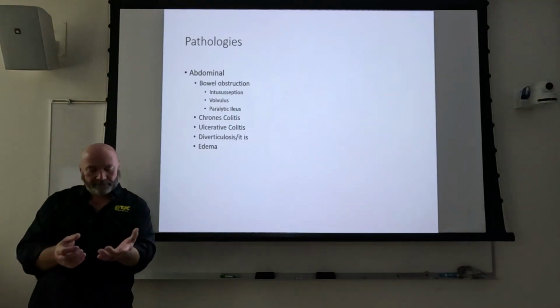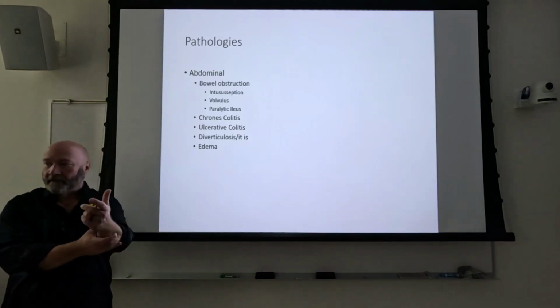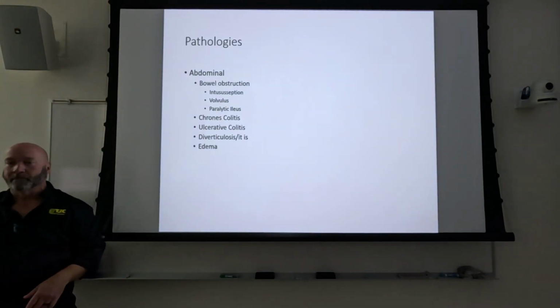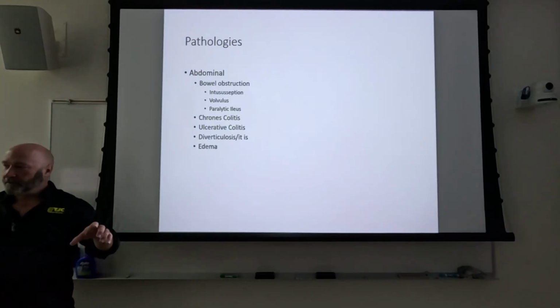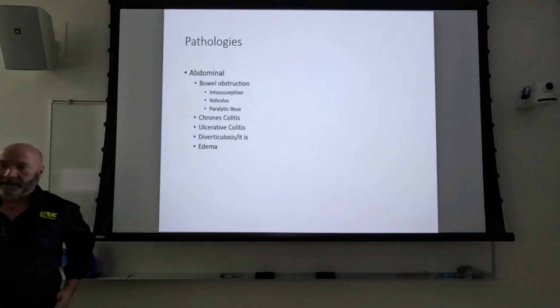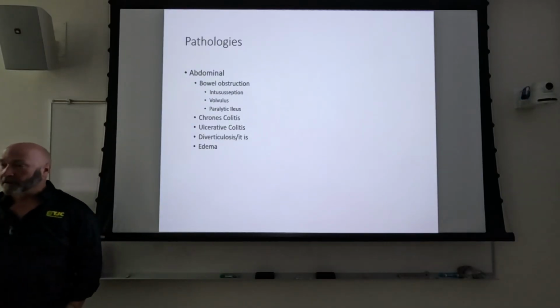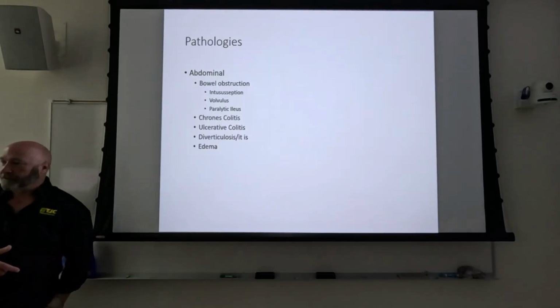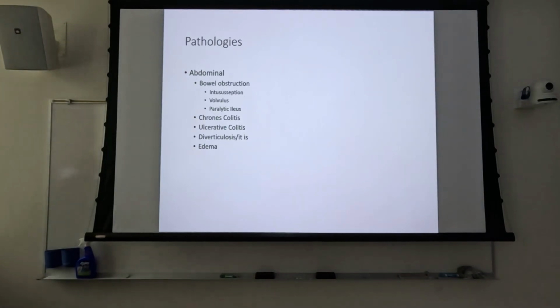And as soon as you let go, what happens to your skin? Pops right back. But if they're full of water, it comes back like memory foam, right? You pinch it in a little bit and it just slowly, it doesn't spring back. So that would be an indication they're full of water. If they're full of water, you're going to have to increase your technique. If bowel obstruction, telltale signs of bowel obstruction, you got to decrease.